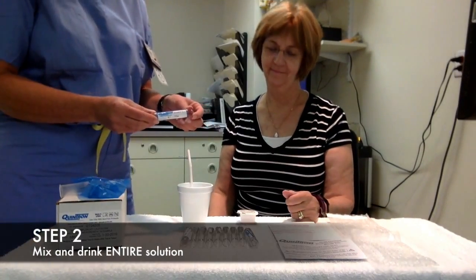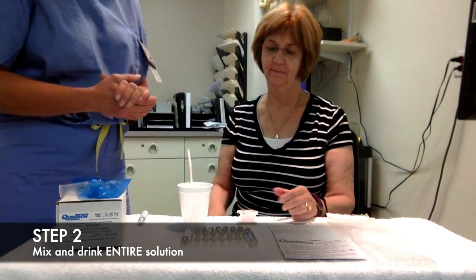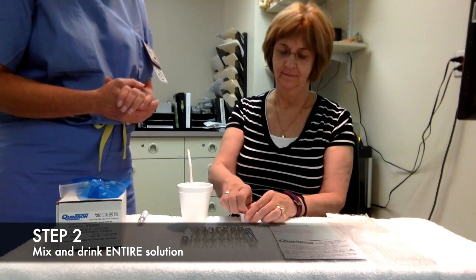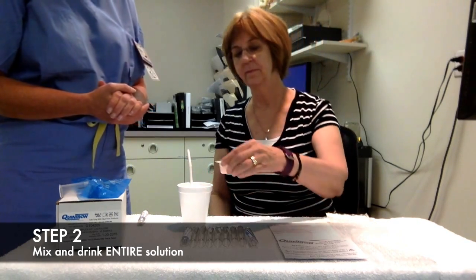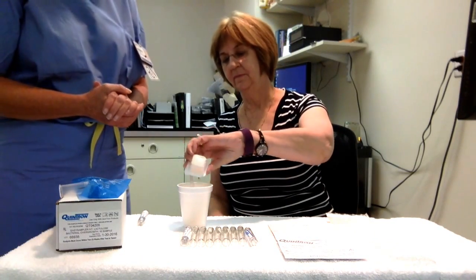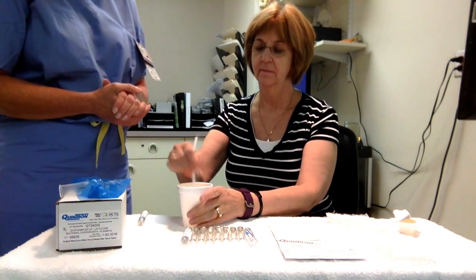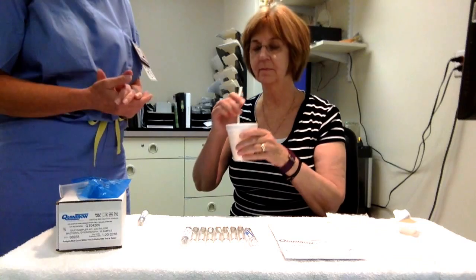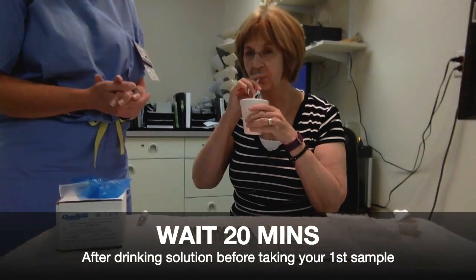Once you've finished your baseline sample, put it aside and open up the solution that you're going to mix with six ounces of water. Once you've mixed it — there you go, nice liquid right there. Drink the entire contents, wait 20 minutes, and obtain your first sample for the test.